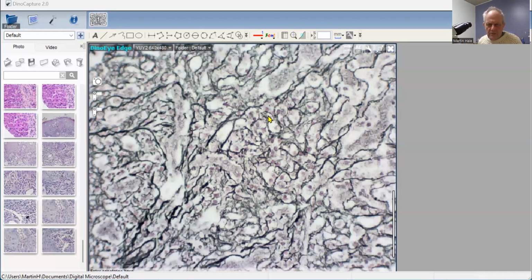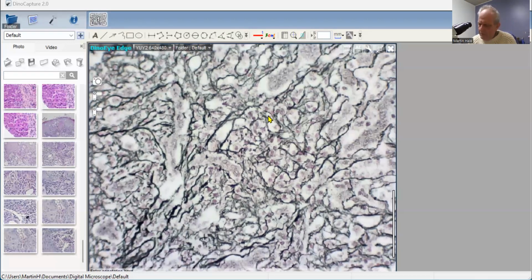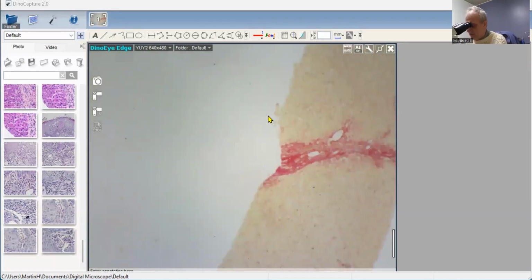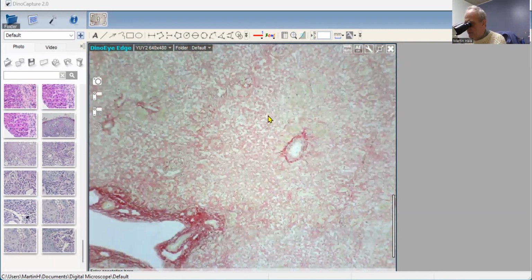Now, if this patient were to survive the insult, in other words, the liver would regenerate, then in fact the hepatocytes would then grow back along the reticulum framework. And if you were to biopsy in a year or two, the liver would be completely normal. And then what we've got is the Sirius red. There's a little bit of fibrosis that's starting to creep alongside of it. A bit of fibrosis is starting to creep into the explanted liver.